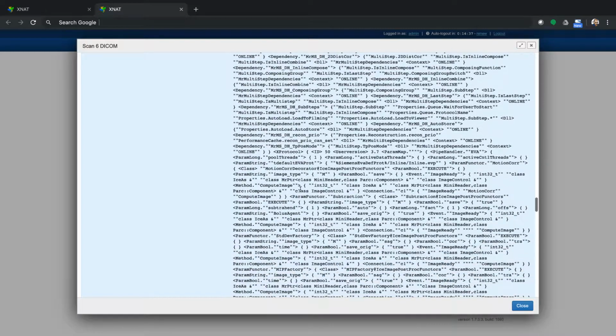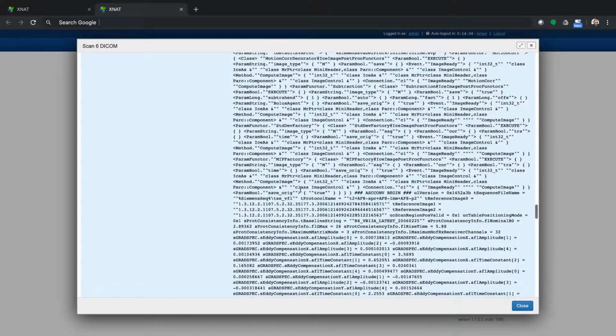There are many scan types, such as functional MRI, DTI, BOLD, or PET, that often have valuable parameter data that is only available inside these vendor tags. Armed with this information, you can construct your anonymization scripts accordingly. But we highly recommend using a temporary dev instance of your XNAT while you're working this out. And you should work with your IT group to properly isolate that dev instance so that data isn't exposed before you're ready.